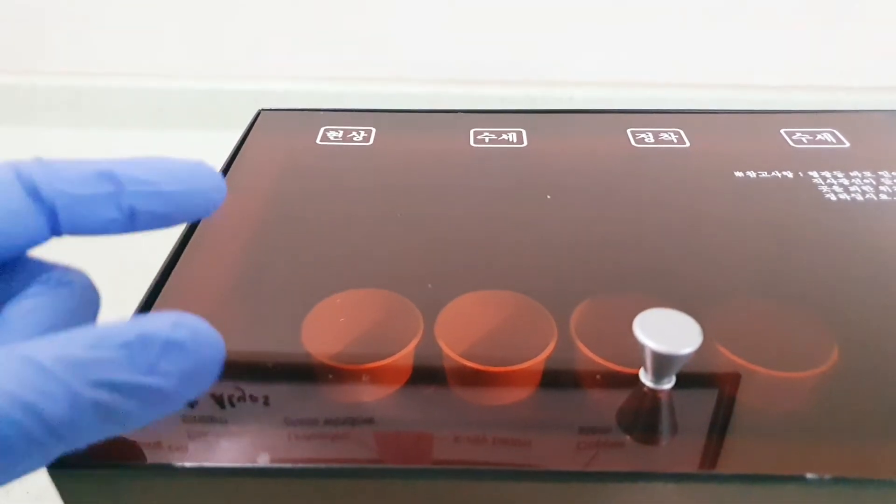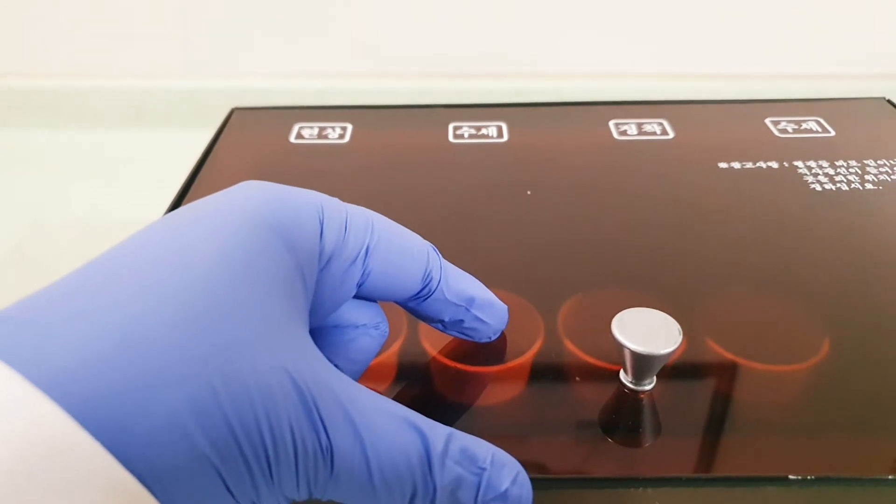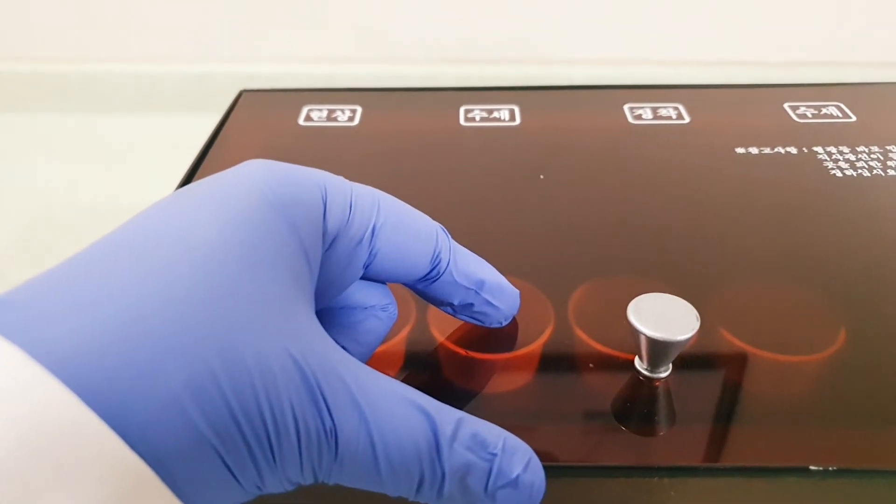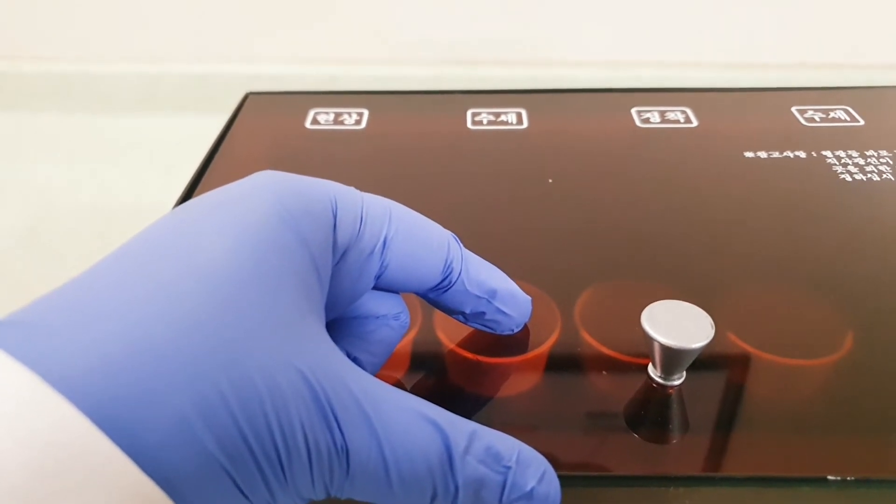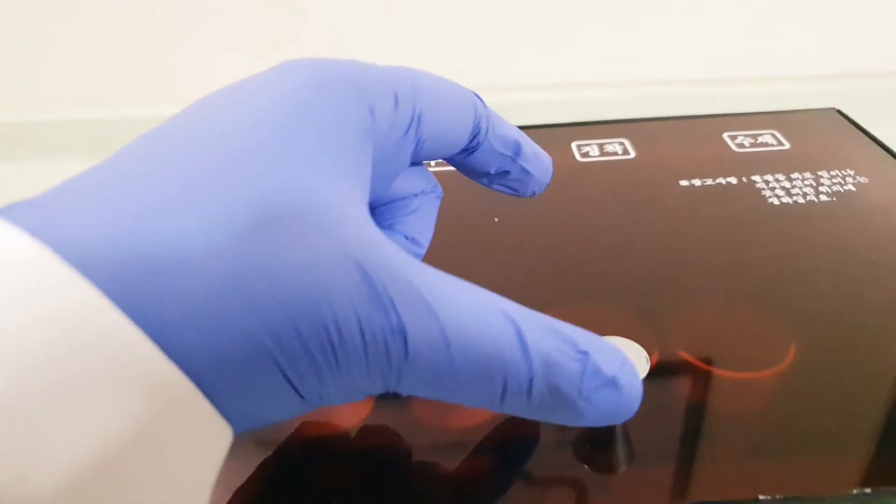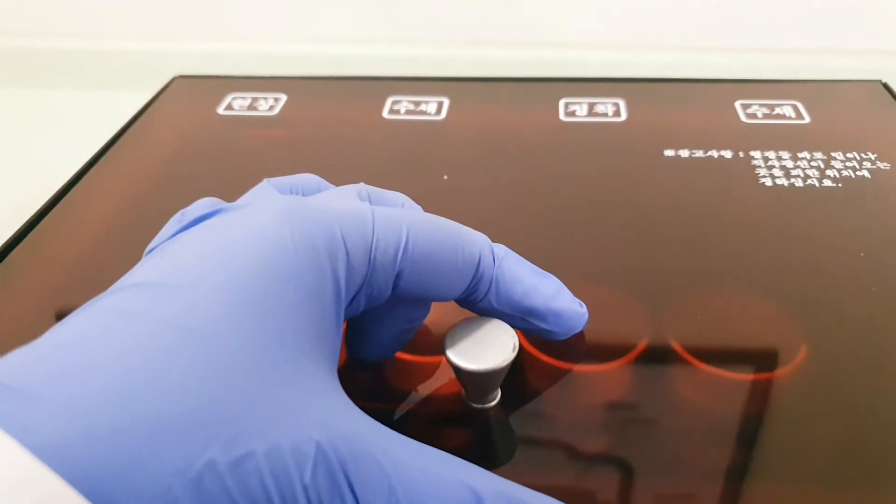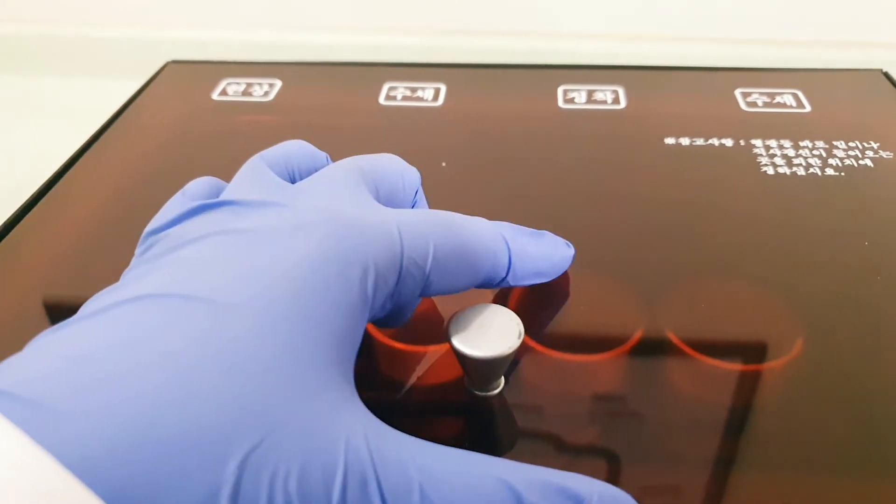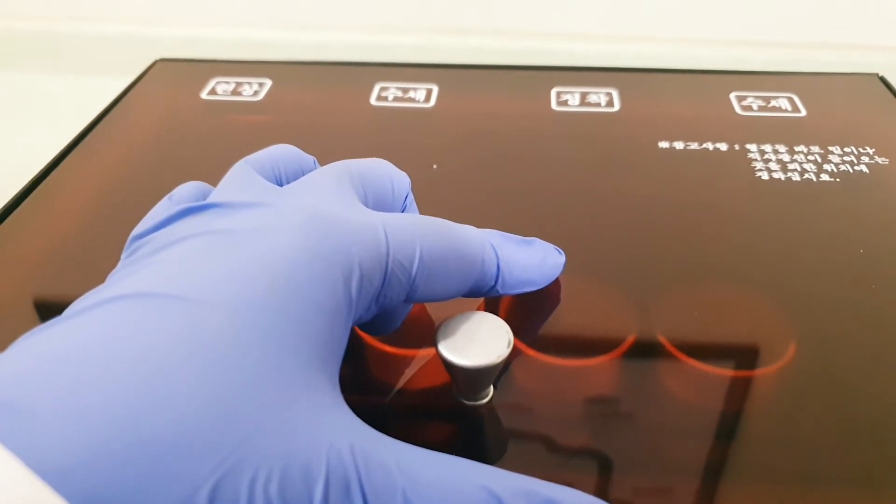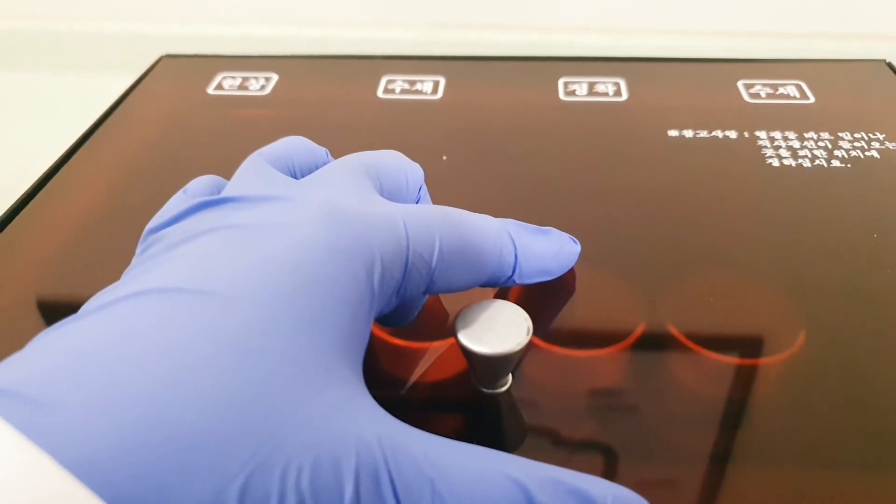Stop the developing process and rinse with water for five seconds. Then put the film into the fixing solution. In this solution, all the unexposed silver halide crystals will be cleared away.